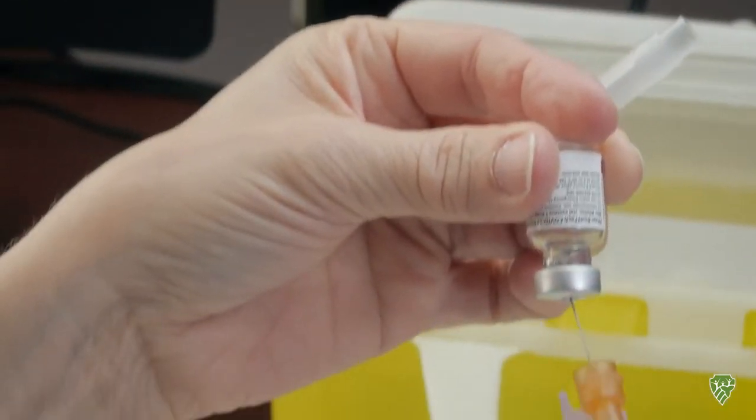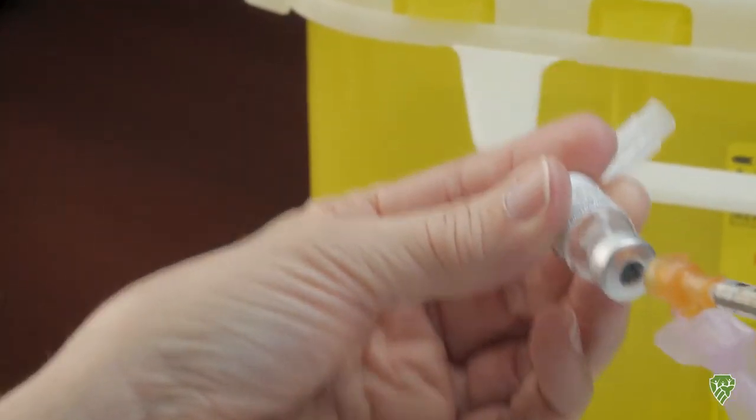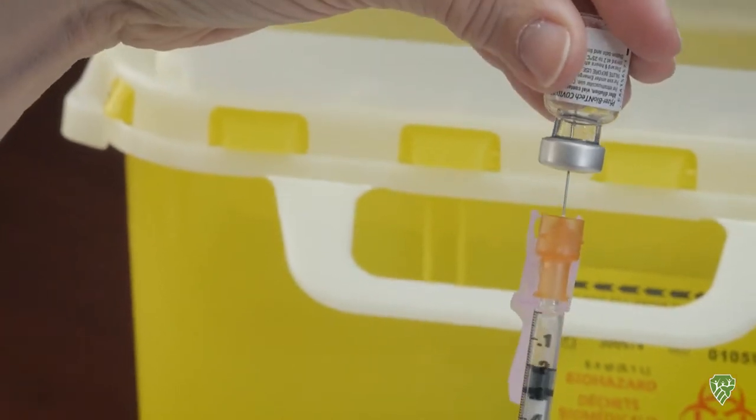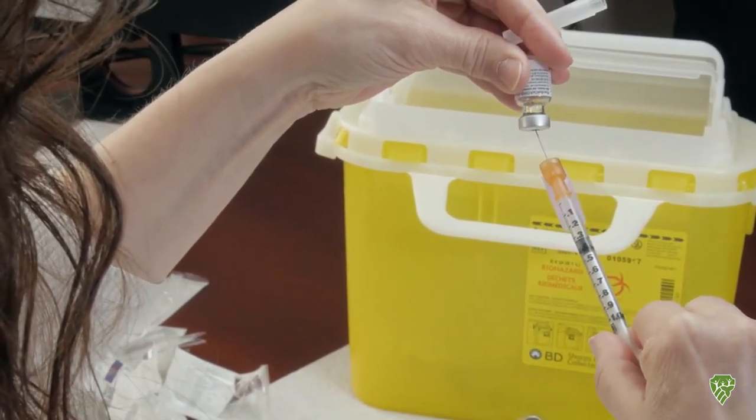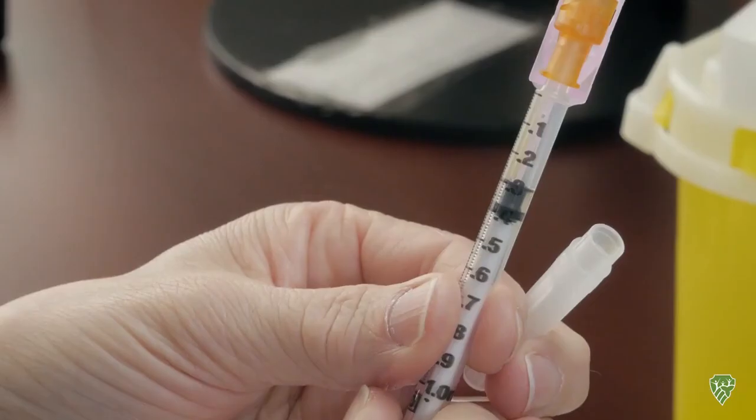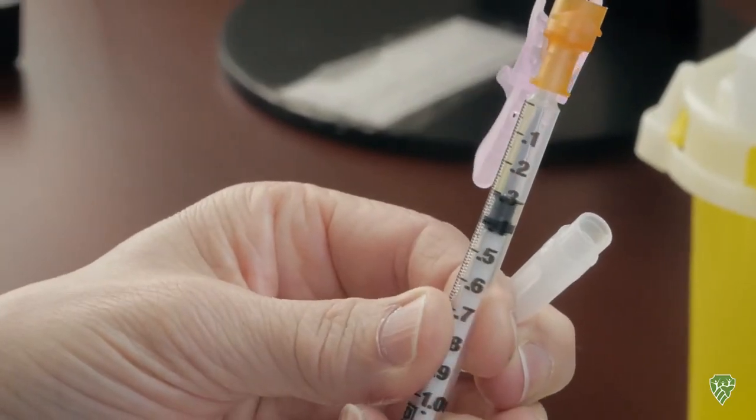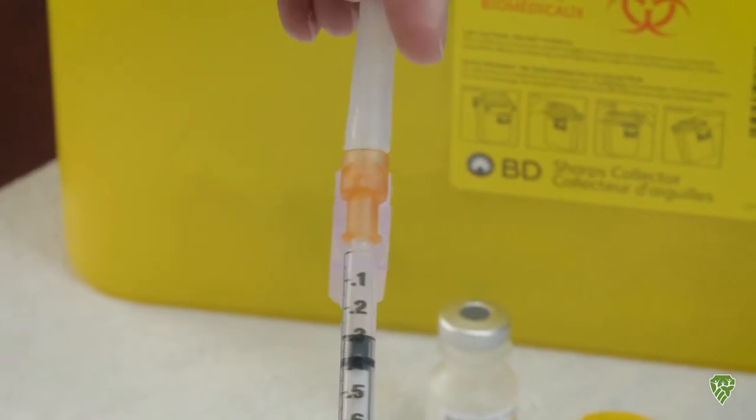Now there is an air bubble at the bottom of my syringe there. I'm just going to turn it around a bit, try to get that bubble out. And there's my 0.3, and there's my 0.3.